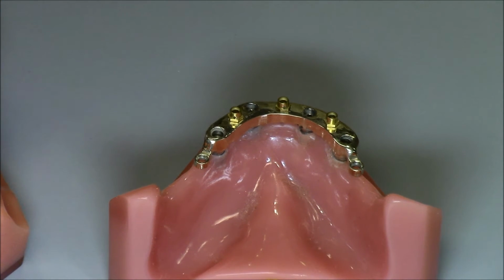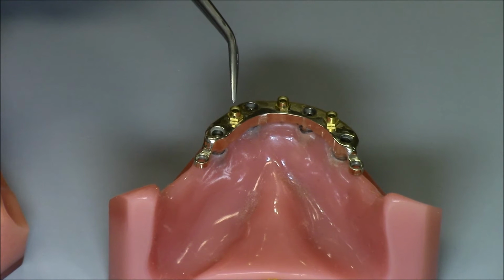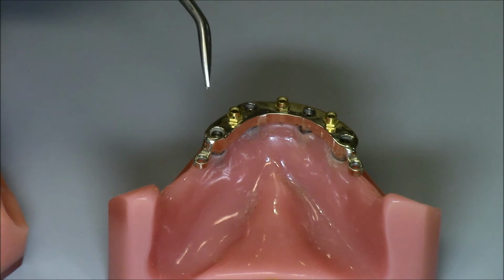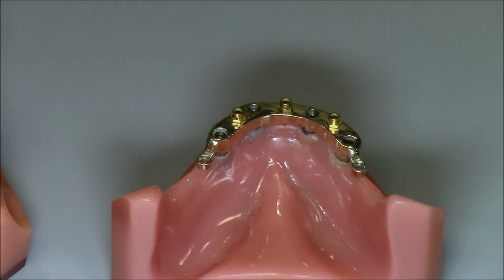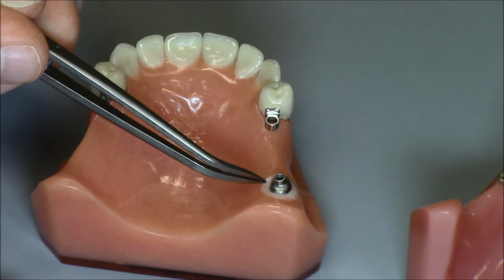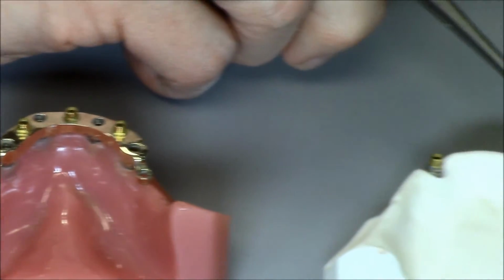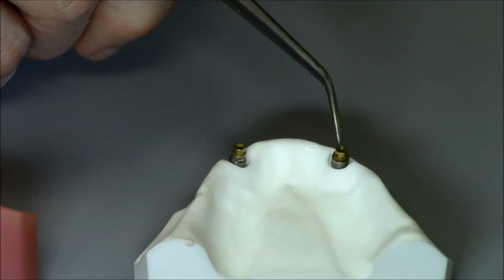The next style is the overdenture. We see it here. We can put it on top of a bar like this, either screwed in or welded on or cast on, or back to our first model, we could cast them on top of an overdenture coping. And then moving over to our third model, we see them here on top of implants.